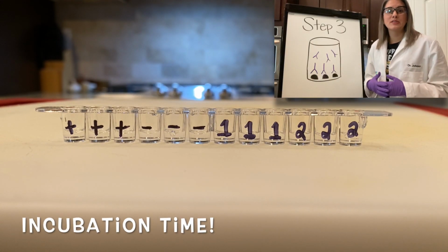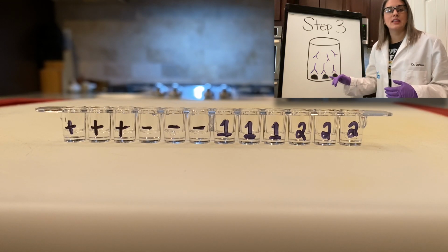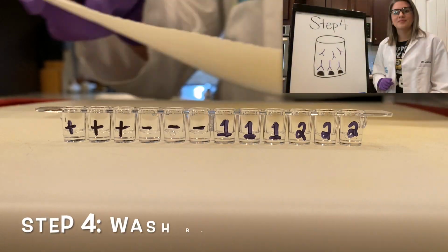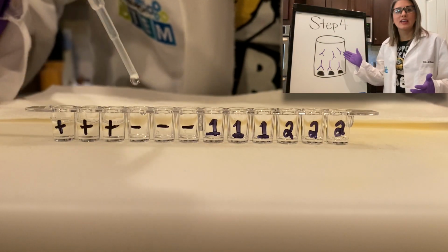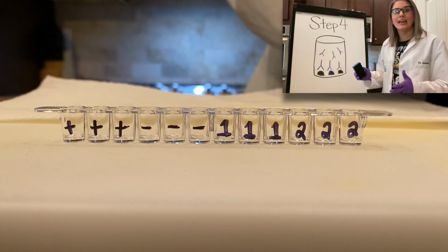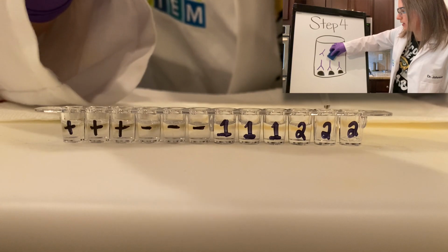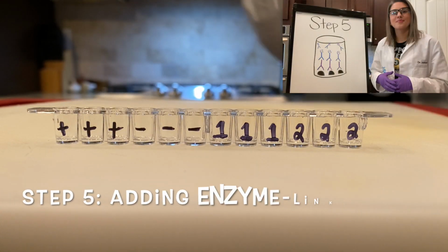Again, we're going to let our samples incubate, so those antibodies, if they're present, will make their way down to the antigen and bind just like they do in our body. Now it's time to wash again. Remember, we're doing this to get rid of any of the unbound molecules. So in this case, we want to get rid of these antibodies that haven't found an antigen to bind to. So when we add that wash buffer in, these guys are going to go bye-bye.